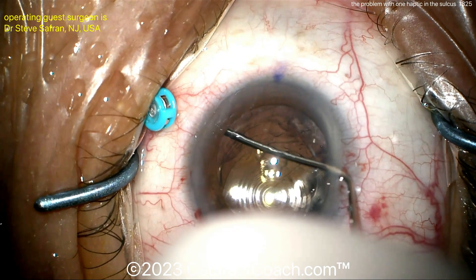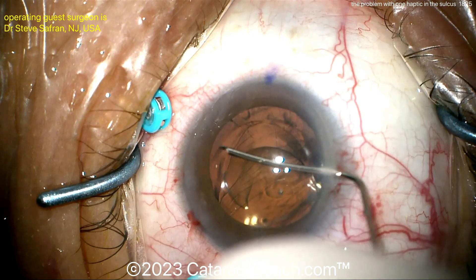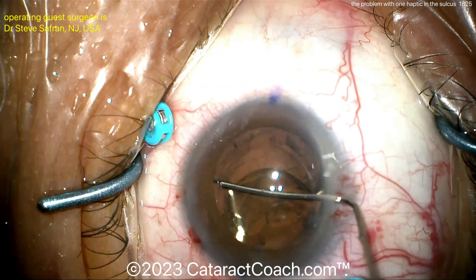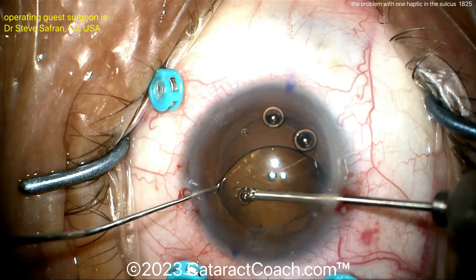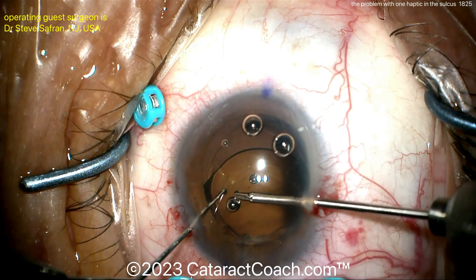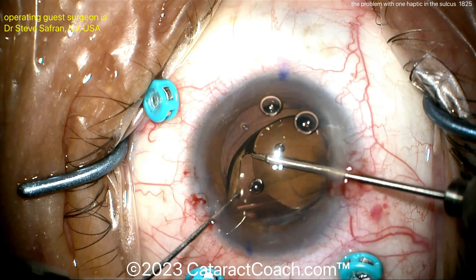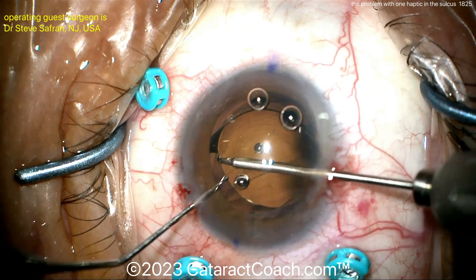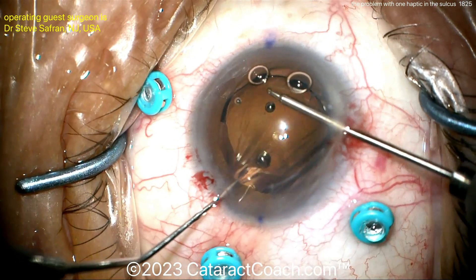So here, going around, opening up the anterior and posterior capsule leaflets — even two years later, it's possible. And now, if you can get that trailing haptic, that inferior haptic there on the left side of your screen, placed inside the capsule bag at the bag equator, that will provide support. There it is, being placed under the anterior capsule rhexis. Now it's in the bag.